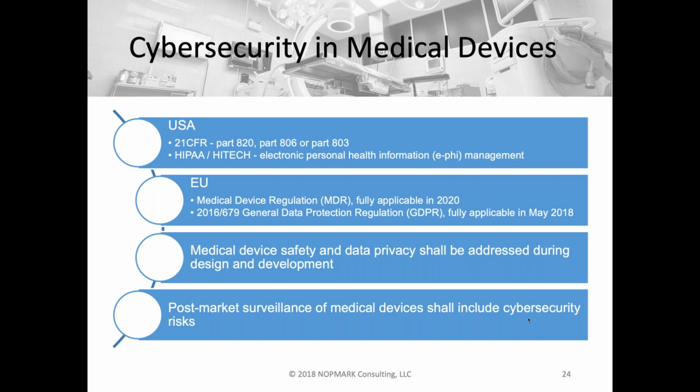The last item we'll focus on is called post-market surveillance. One of the regulations that's out there is called post-market surveillance, which means after your software is done, after you ship your software to your customer, you have to, at least annually, and that's the current regulation within the EU, within the MDR, at least annually or biannually.